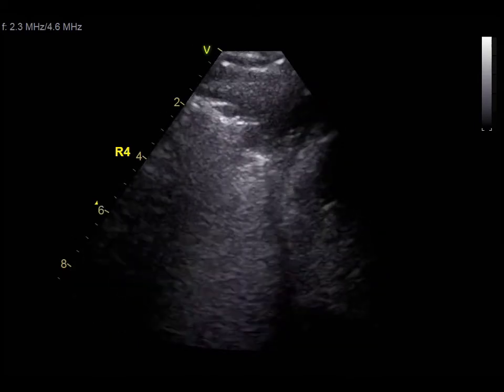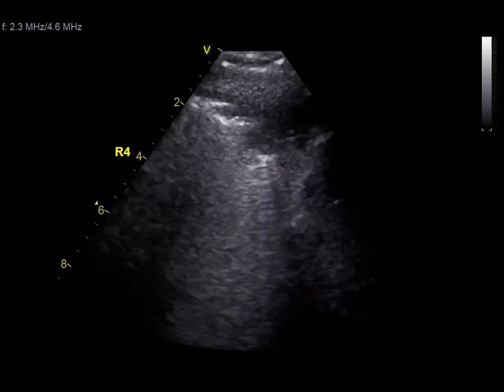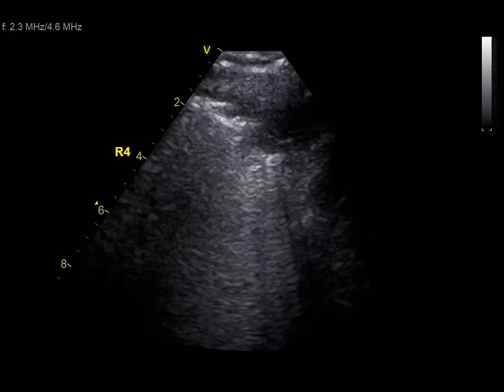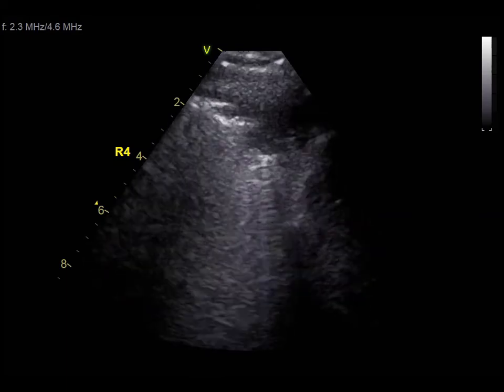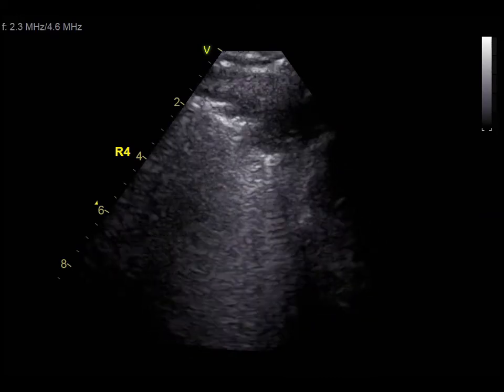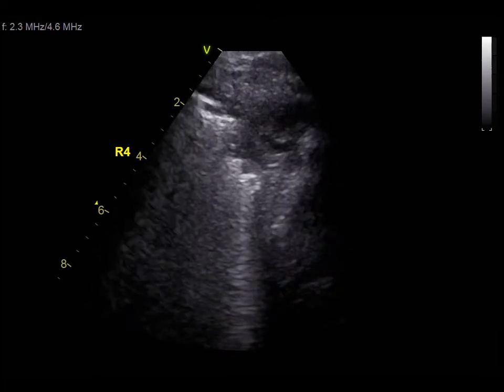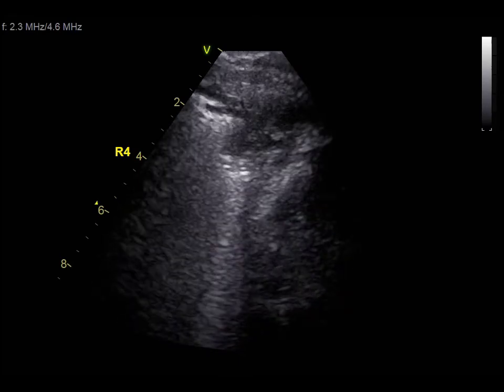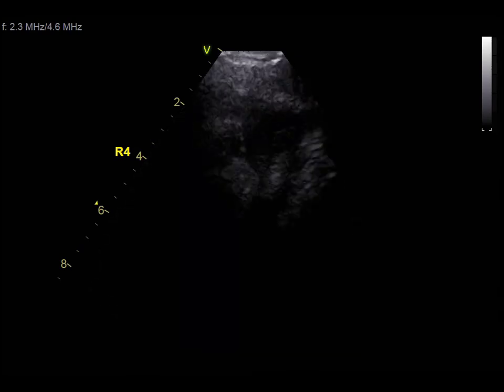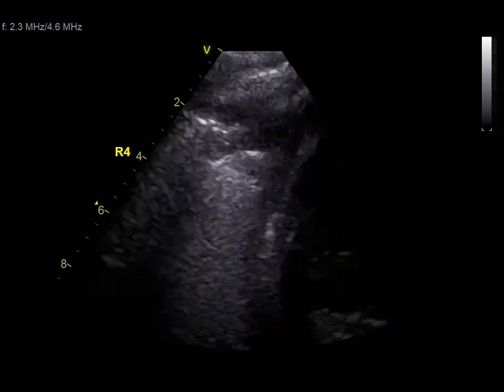And then right 4 down on the liver. So you see that there is a larger area of consolidation there. That white line that you see there is the shred sign. So that's the boundary around a larger area of consolidation with some B lines coming off it. See how all this wedge-shaped abnormality is an area of consolidation. That's a big consolidation, and that white line around it is the shred sign. These are the B lines that you know from previous images.